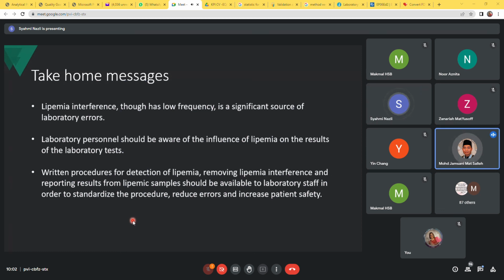Tapi perlu diingat jangan hantar sampel yang tanpa centrifuge sebab dia akan mengganggu juga analisa berdasarkan stability of analyte disebabkan delay in centrifugation. Dan Encik Syafiq kita akan share slide lepas ni lah. Okay, ada soalan yang lain?